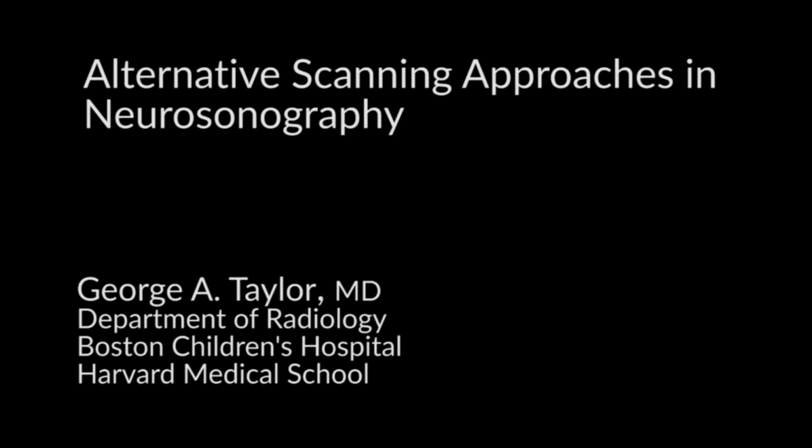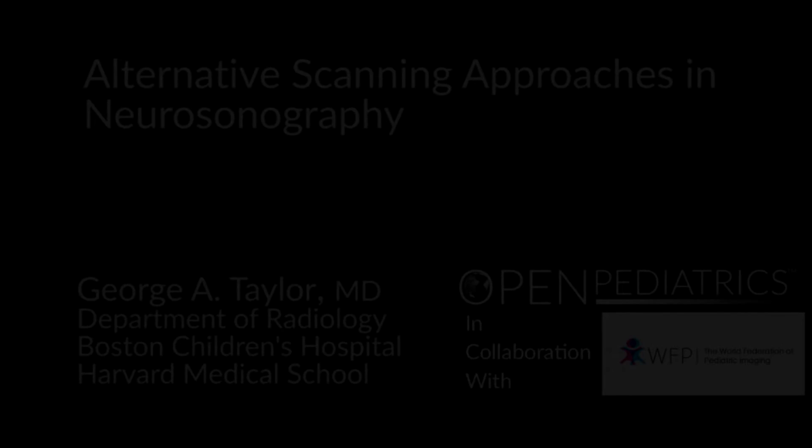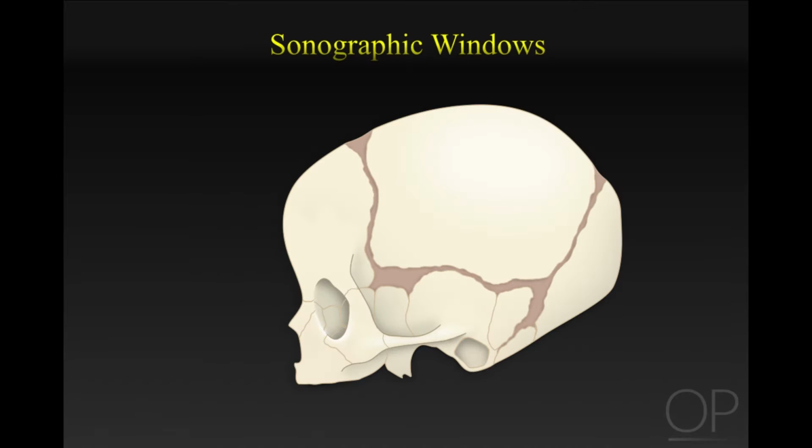Alternative Scanning Approaches in Neurosonography by Dr. George Taylor. This talk addresses the alternative scanning approaches possible in neurosonography as a way of expanding the diagnostic capacity of ultrasound and as a problem-solving tool.